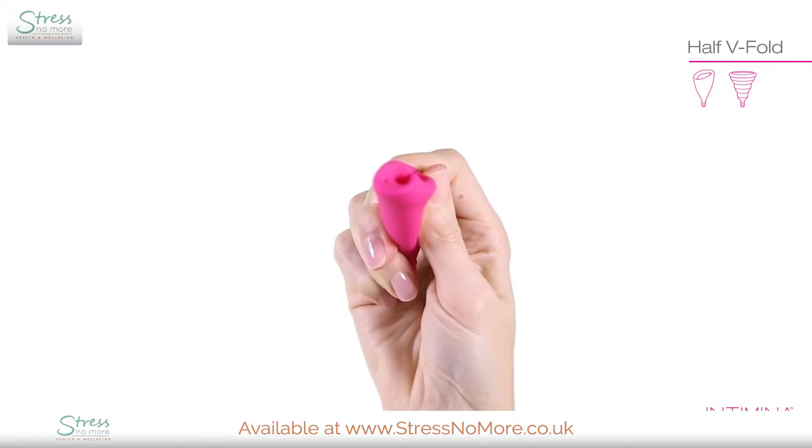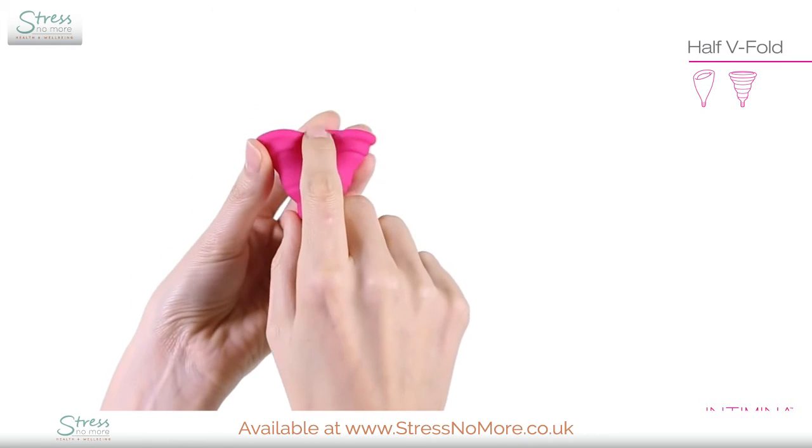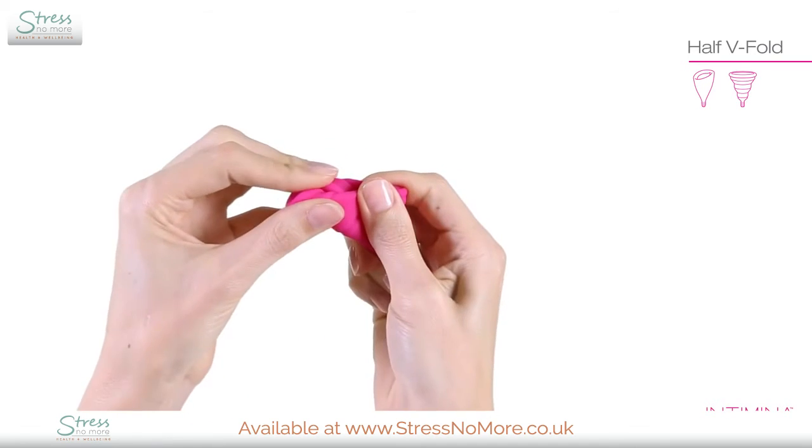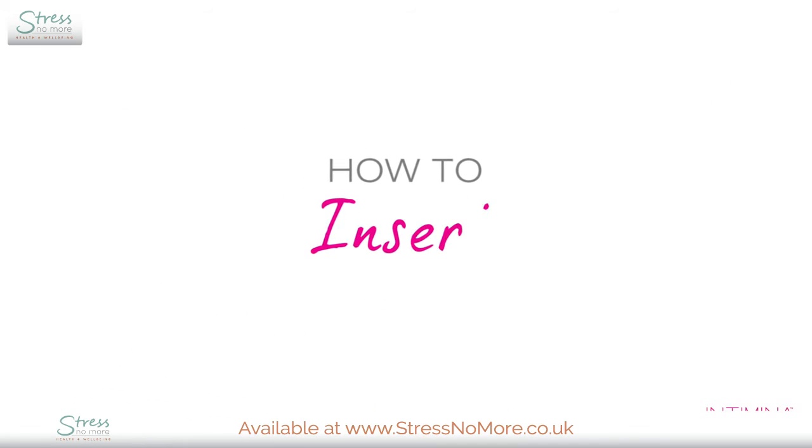You will insert the pointed end first. This is how it looks with LilyCup Compact. No matter which cup you have or fold you choose, it is inserted in the same way.